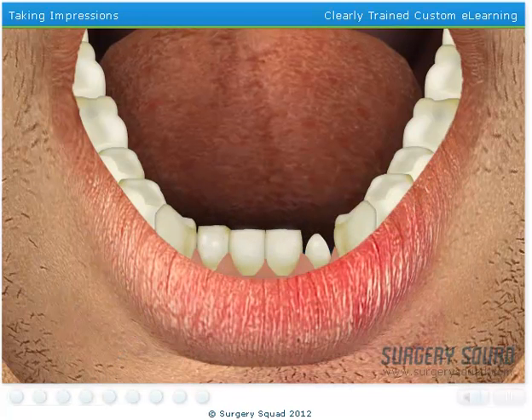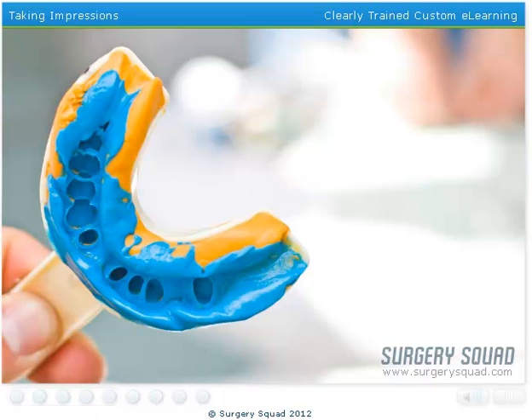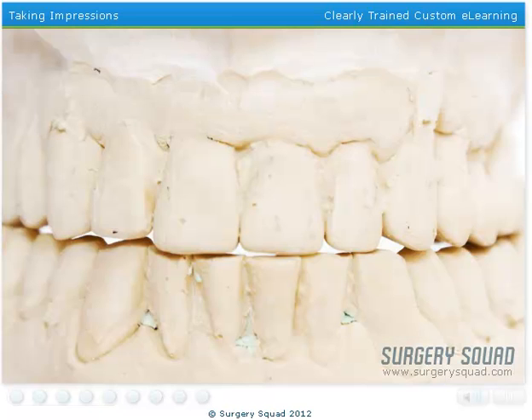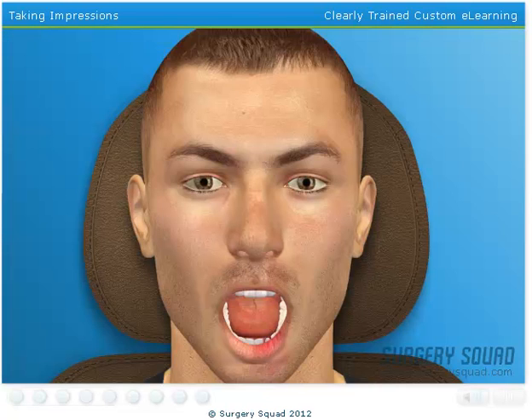That'll do. Now that the tooth has been shaped, we'll need to take impressions of our patient's teeth. This is done by placing impression trays into the mouth and having the patient bite down on them. These trays are filled with a putty-like substance generally referred to as impression material. The impression material is used to create a plaster cast and is then sent to our dental lab, where a dental technician will make the patient's permanent crown. Go ahead and make the impressions of our patient's teeth.